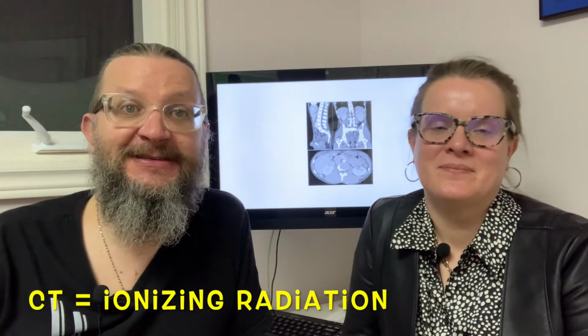So for the next technology, we're going to talk about CT scanning. And what CT scanning is, it uses the same ionizing radiation that X-ray does, but instead of taking one picture, it basically takes thousands of pictures. And so you sit into basically a large enclosed area, and the X-ray tube will actually go around you, and it takes a spiral picture of your body.